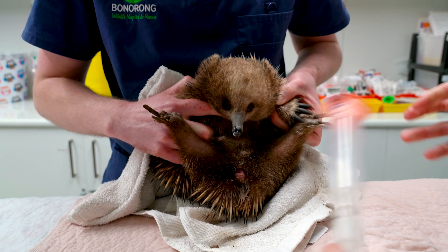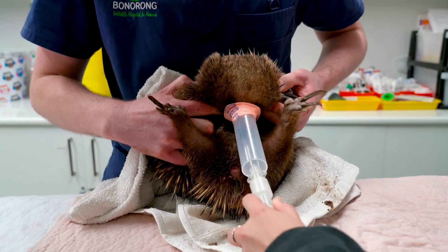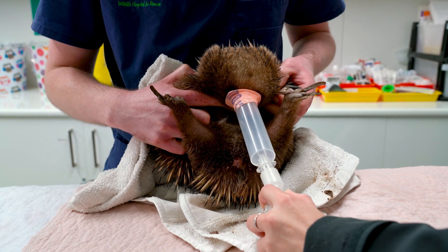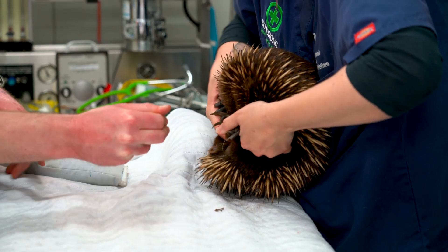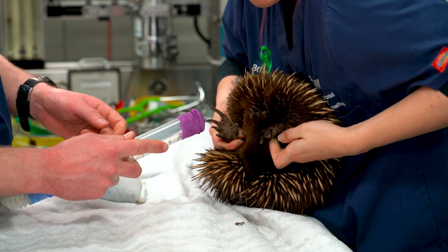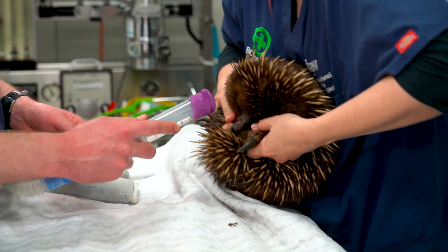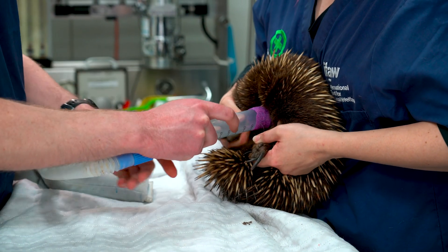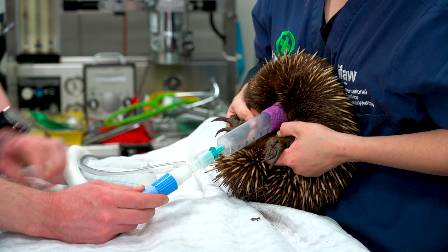When we go to anaesthetise an echidna it's a two-person job. One person will be holding both the front hands and keeping them abducted. Echidnas will try to swipe the anaesthetic mask away, so the person holding the echidna needs to hold those front hands nice and tightly, and then the person holding the mask threads it onto the beak.